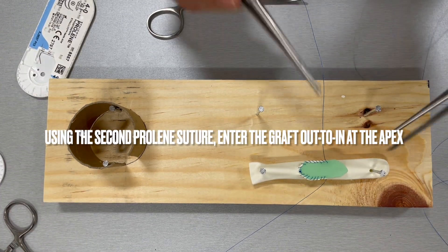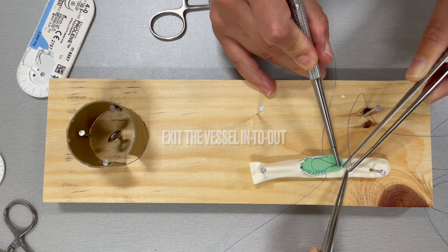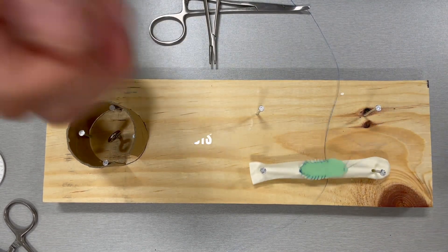Using a fresh proline suture, enter the graft out to in, followed by the vessel in to out. Pull the suture halfway through. Tie the suture.